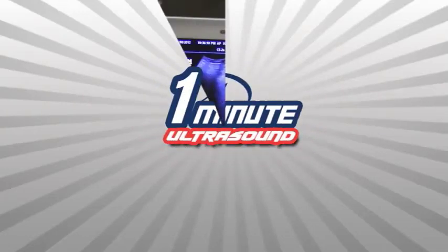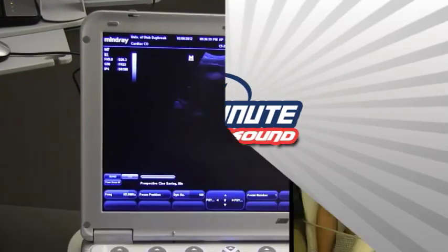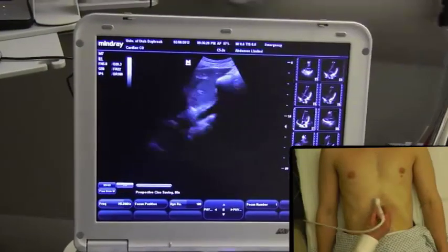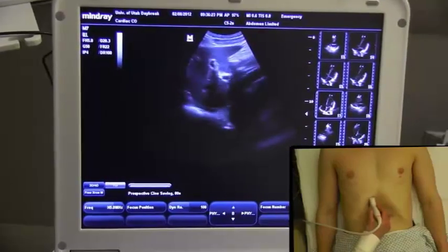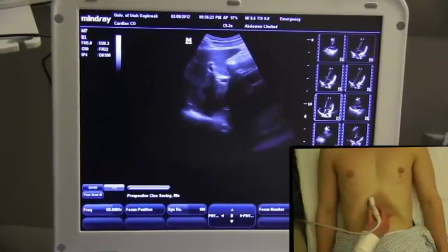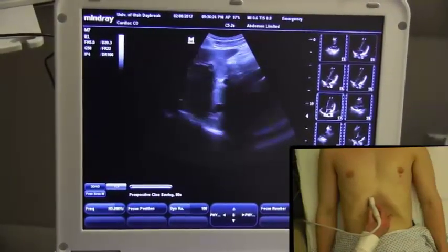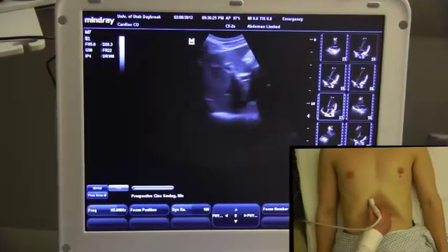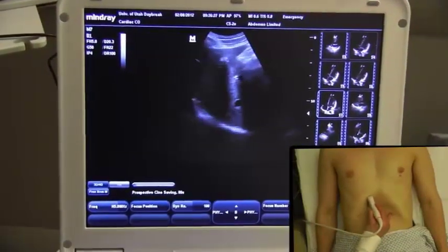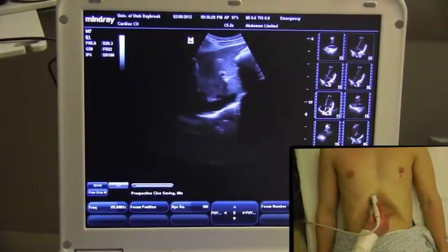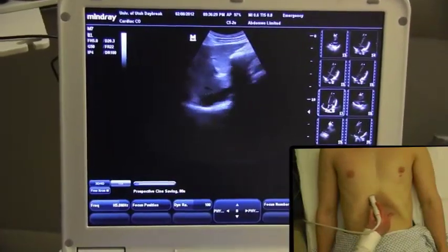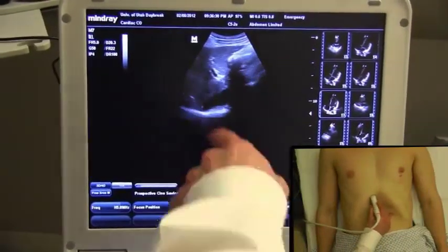This is one minute ultrasound for the IVC measurement with respiratory variation. We'll start with the patient in the supine position. The probe will be just to the right of midline on the patient's mid-epigastric region, and the probe marker will be pointed towards the patient's head.